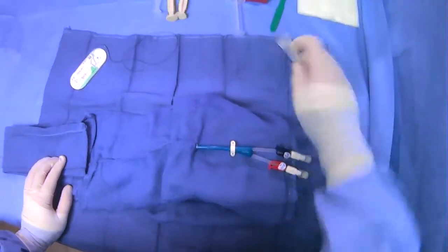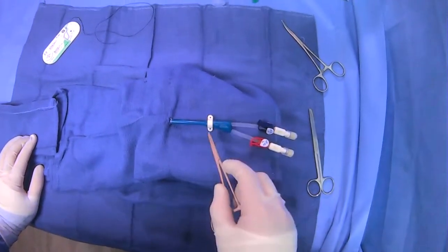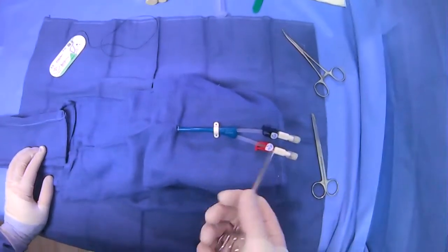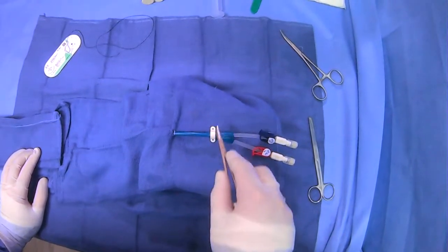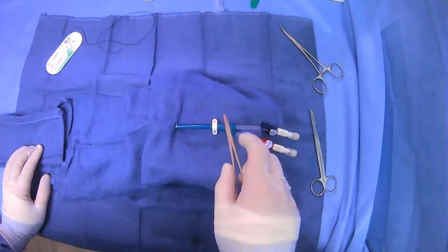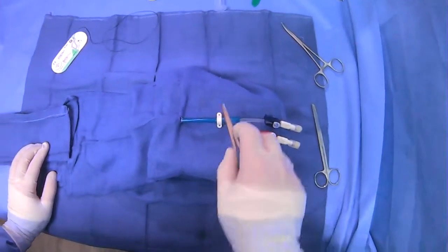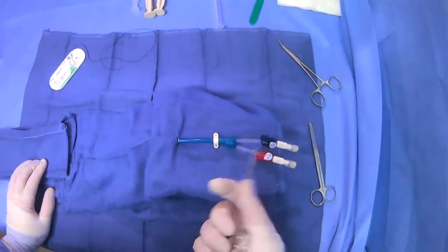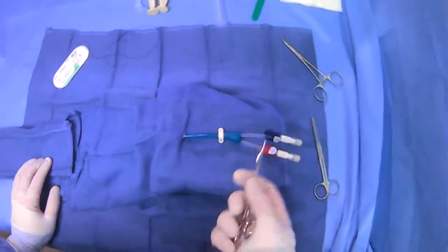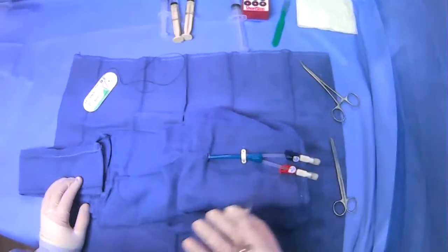Some people like to suture each hole individually, but others prefer to just do one loop that goes in through one side and out the other. There are pluses and minuses. In theory it's more secure if you have two, because if one breaks you at least have one. But some people believe it sits a little more nicely when you're just doing one loop, because you don't have two things pulling in different directions. It's also easier to remove the catheter, because you just cut one loop very easily. So there are pluses and minuses — it's good to be familiar with both and see what you prefer.